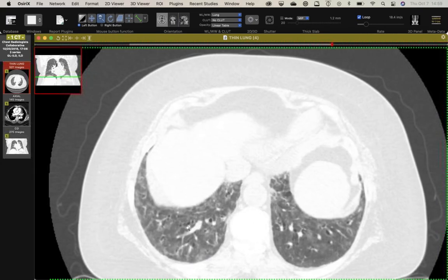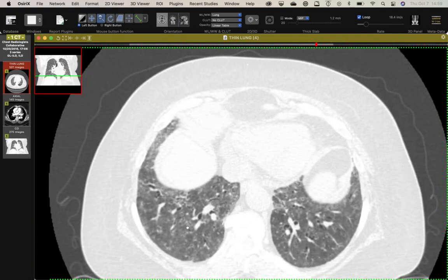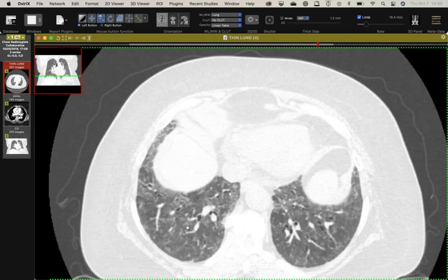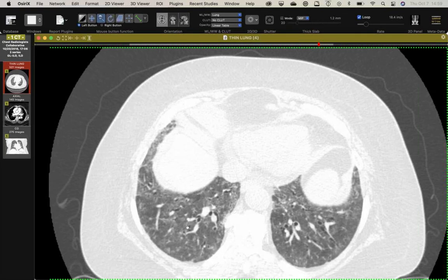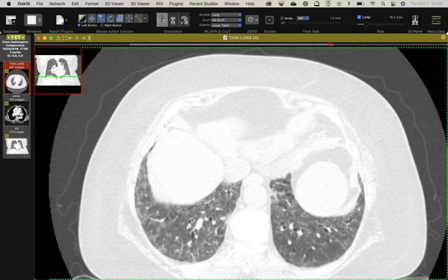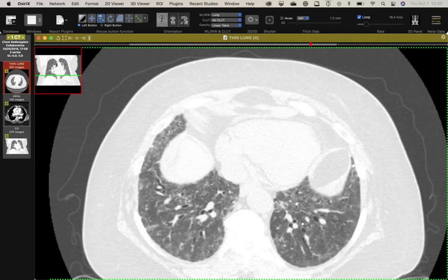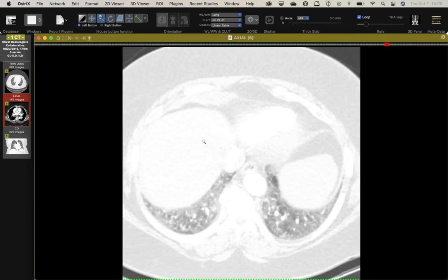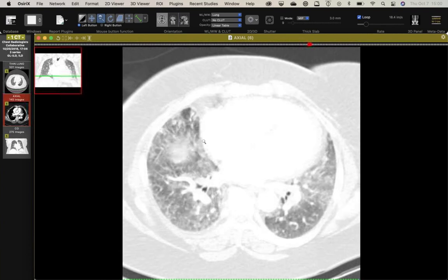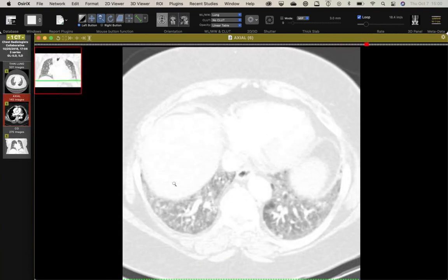And I've not seen that. I'm not seeing a lot of people with CVID treated with IVIG, but has anyone ever seen that, either as a complication from the chronic inflammation or as a treatment effect, where some sort of immune response causes local tissue injury? It almost looks like an NSIP-like look to it. Can you go back to the initial study? It's not a great scan, but you can see all these nodules. But I didn't see any fibrosis back then.